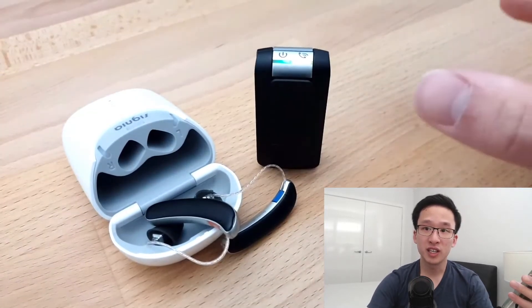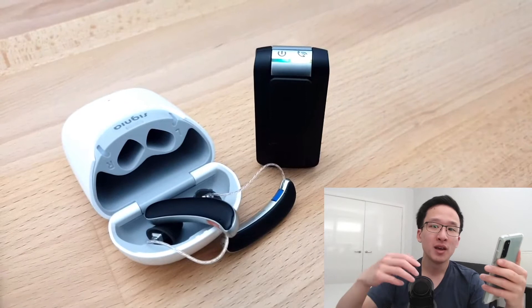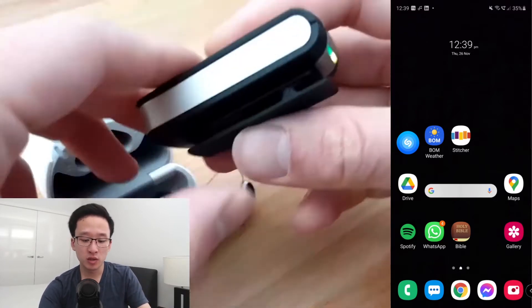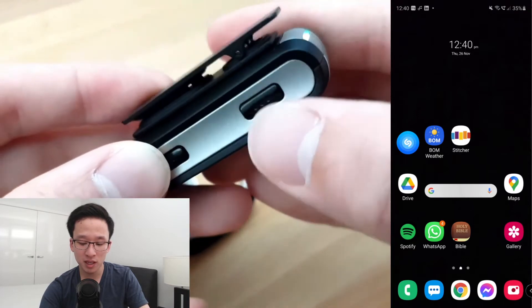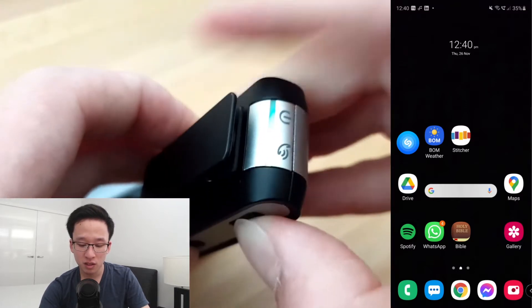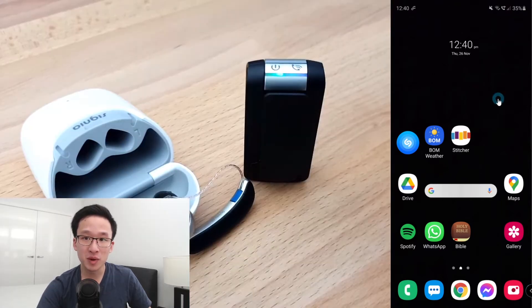Once these two are connected together, we can then connect to our phone, laptop, or TV. In this example, I'm going to be connecting it to my Android phone. The first thing you want to do is put your Streamline Mic into pairing mode. You do this by pressing that same multi-function button as well as the volume up button, pressing and holding until the yellow light turns blue. Now it's flashing blue — it's in pairing mode.